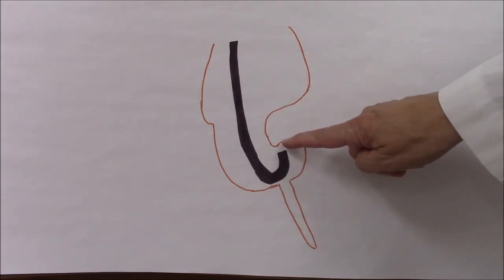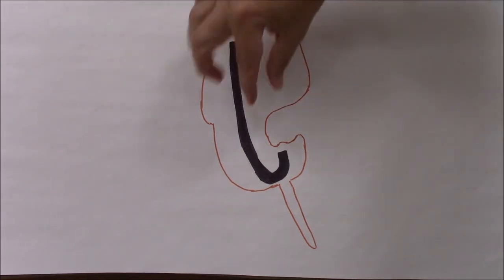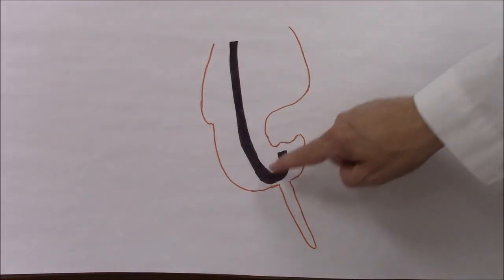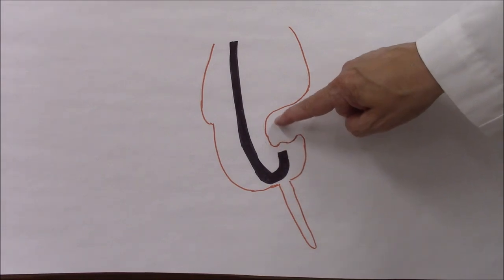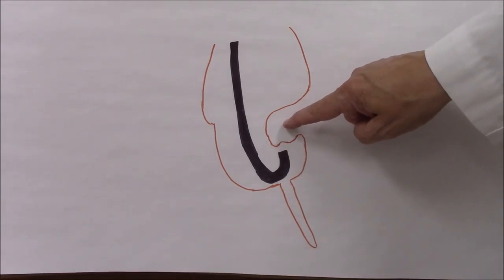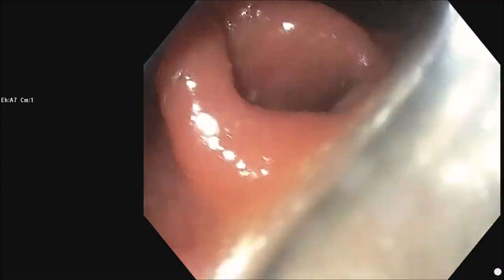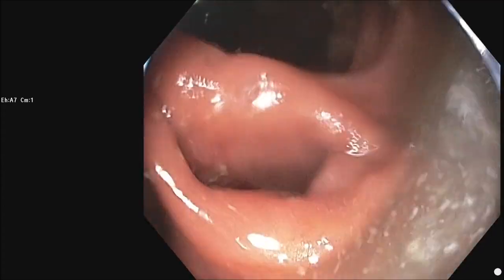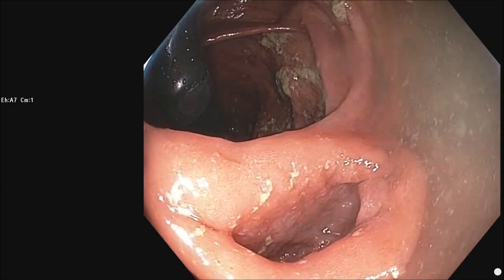look directly at the valve orifice as it's sort of pointed toward the cecal side, and then just pull the scope back in the retroflex position and pull the tip of the scope right up through the ileocecal valve into the terminal ileum. So if I get to the point where I'm resorting to this technique, retroflexion, primarily to get into the TI, often I've switched to a thin scope.